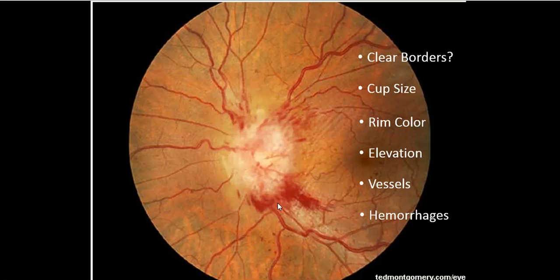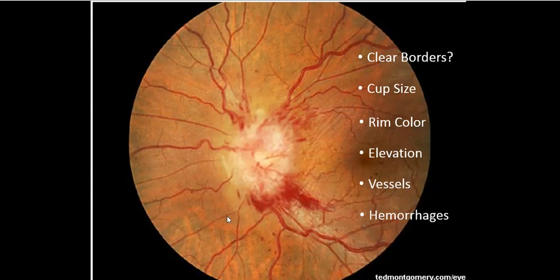Hemorrhages: this reddish color that we're seeing out here is hemorrhage. It's not a vessel going anywhere — you can see there's no path that it continuously takes. This also would be a hemorrhage, and so would this area. Sometimes it's difficult to tell whether what you're seeing is a vessel or a hemorrhage, even for the ophthalmologist. But we see clear examples of hemorrhage in this picture. And exudates — this lesion over here may be a form of exudate, something that's there that shouldn't be. So this is clearly an abnormal optic nerve.